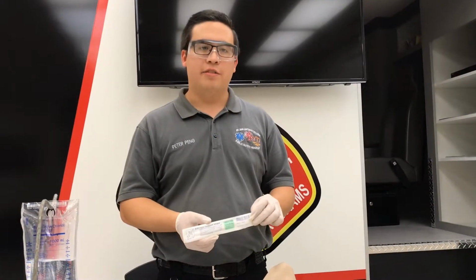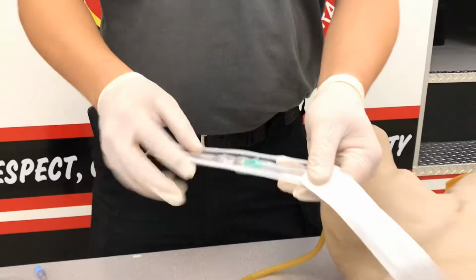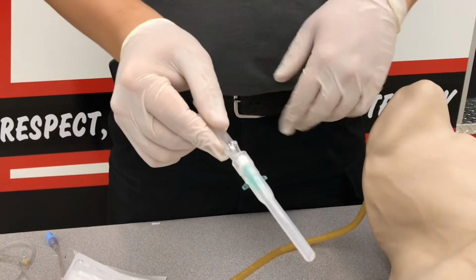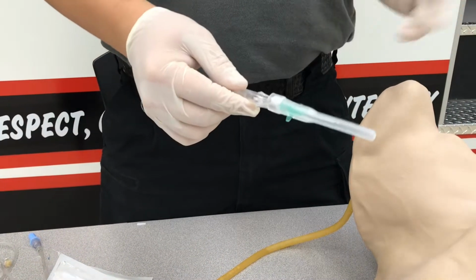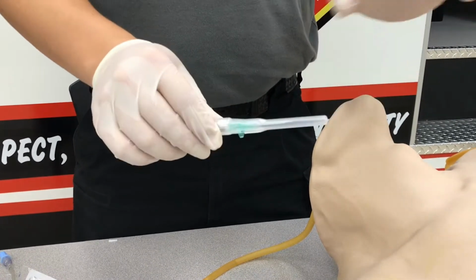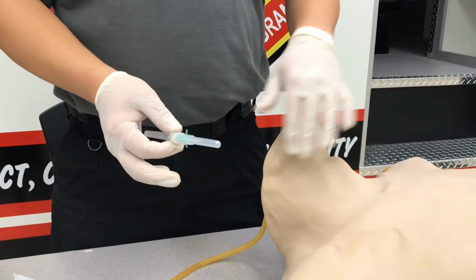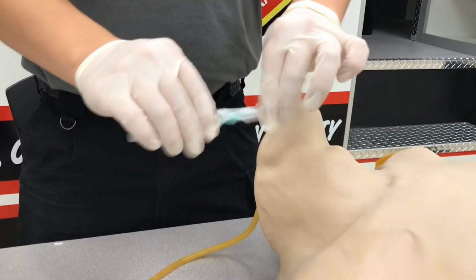So this is a different kind of IV catheter. It's still an 18 gauge, but it's a little bit different. This one has a button that we're going to click to retract the needle, and you use it a little bit differently than the one that you retracted earlier. So our patient is the same, and we've already gone through everything else. This site has already been cleansed, so I'm going to open it up.